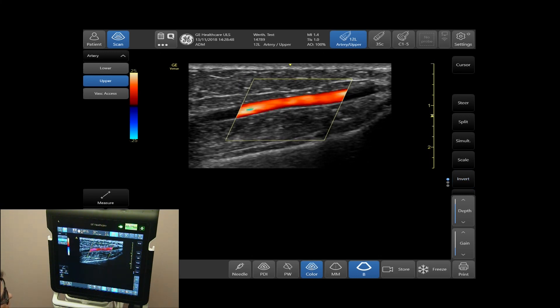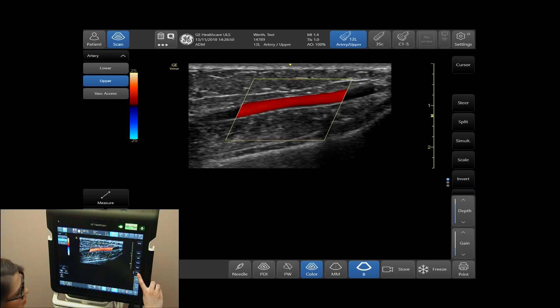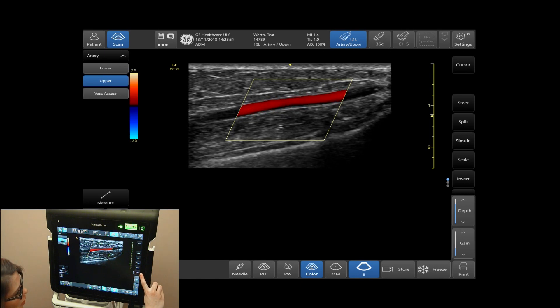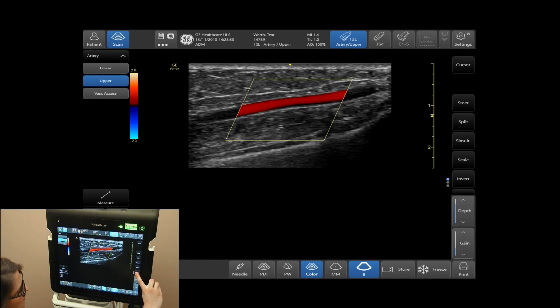To invert your color, tap on Invert on your side panel on the right side of your screen.